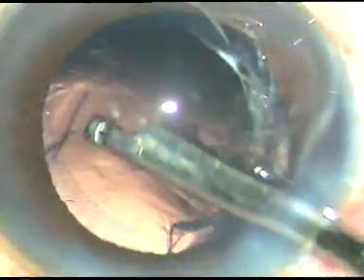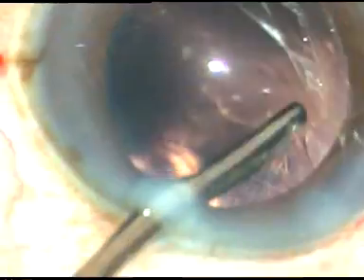Now the cortex is being removed. Before removing the cortex, what I did was remove any epinuclear or nuclear fragment first — because small nuclear fragments may get lost underneath the iris. So before removing the cortex, as soon as you see any nuclear fragment, it must be removed first.